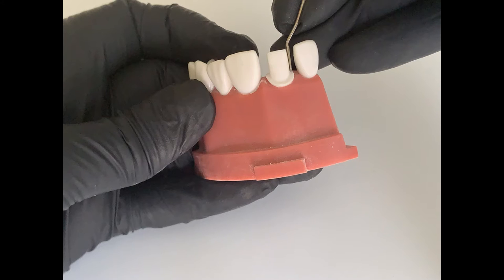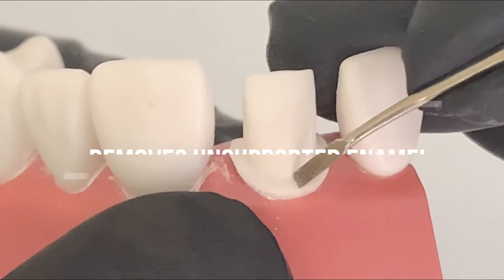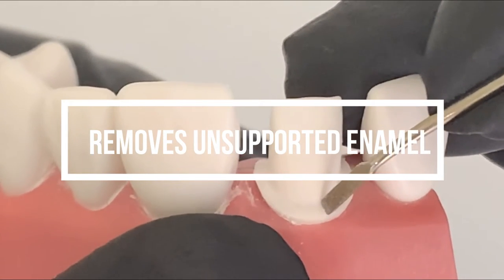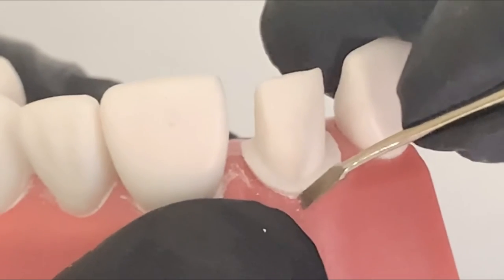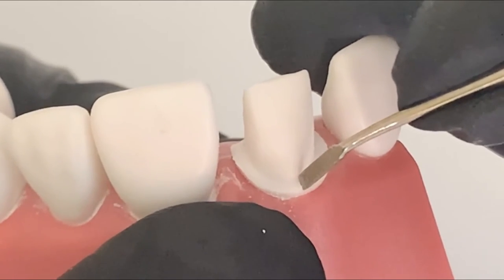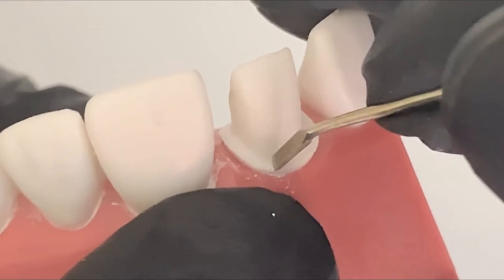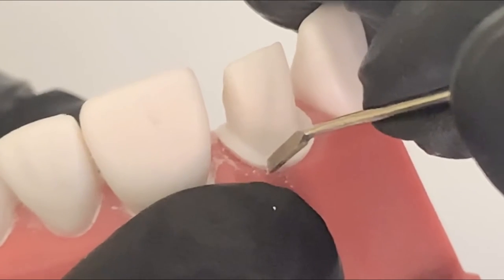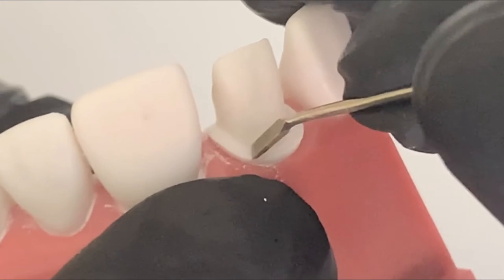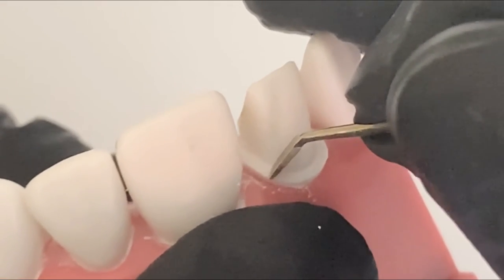The next use of the enamel hatchet is to remove any unsupported enamel, which is very important. Not only does it smooth out your finish line, it also removes lipping. Lipping is a deficiency error — if you have any, you must remove it, otherwise the subsequent crown fails. This is important not only for the bench test but also for practical purposes. To remove unsupported enamel, go over it with the working edge of the enamel hatchet towards the tooth structure, gently, without digging in.